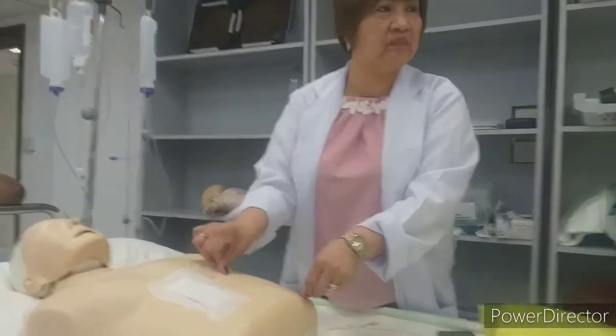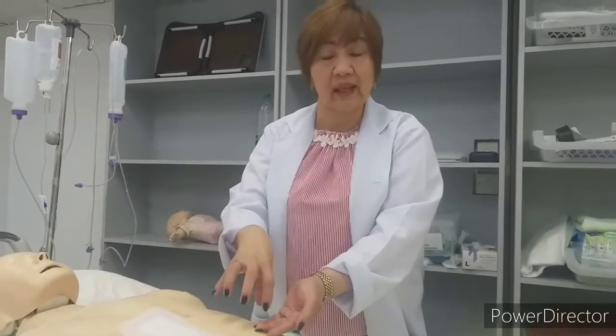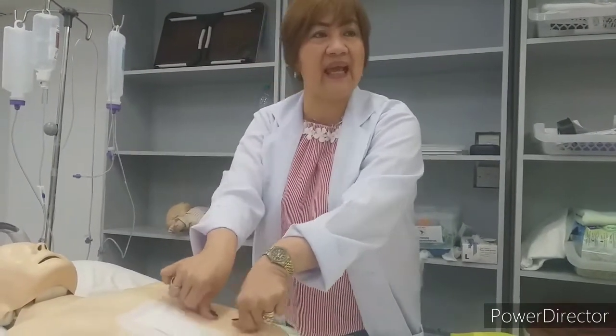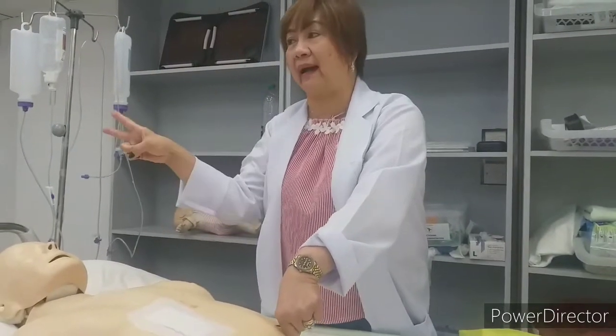May adhesive siya. Yung mismo, ang adhesive is under the pan. So, the one that I'm talking to you now is the colostomy bag. There is no adhesive, only just like ziplock. Yung top bibig, so, zip it lang. Press it, yeah. Press only. Okay? So, there are two kinds of colostomy bag.